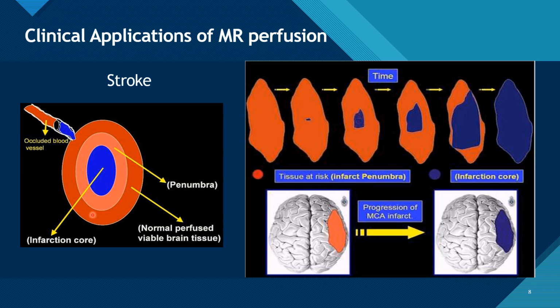not been affected. So what this means is that over time, after this occlusion of the vessel, we have a large area of tissue at risk, which is represented in red, followed by central necrosis. This central necrosis increases over time with a decrease in the area of tissue under risk, and with progression of time, without any kind of treatment, all of this tissue will turn into a completely necrotic area or a large infarct core.